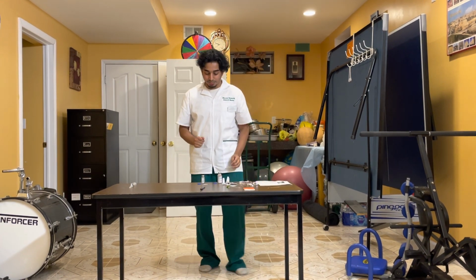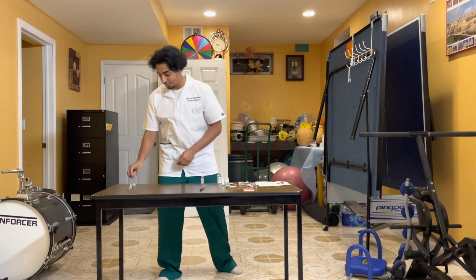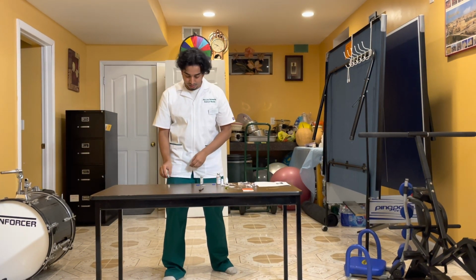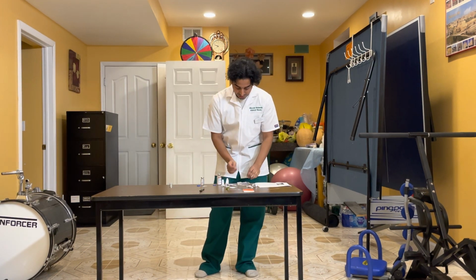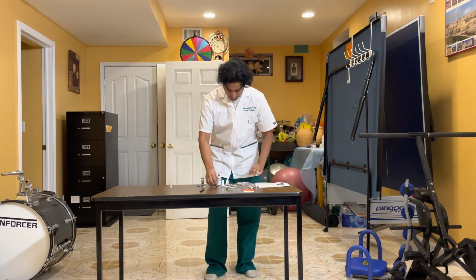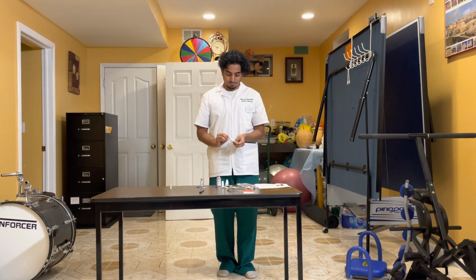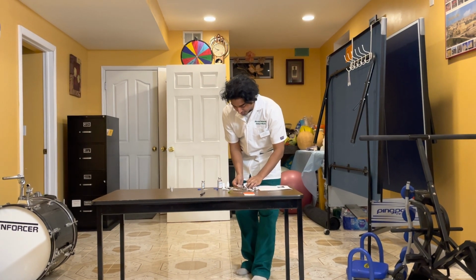Now the next thing I'm going to be doing is inserting the vancomycin into the IV bag. So I'll be taking out my needle. Before I take out the needle, I'm first going to take out the cap for the IV bag, and I'm going to be cleaning it with the alcohol pad for 10 to 15 seconds.